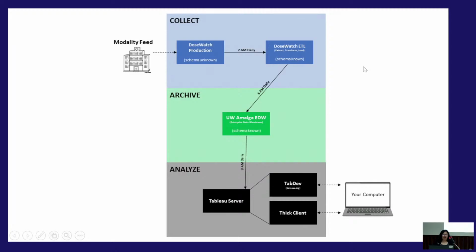So this is the way our setup is. From the modality, just like Sam mentioned, once an exam is completed from the scanner, the dose goes to PACS as well as to Dosewatch. And that's where it's collected. Then we have an archive server, or what they call an enterprise data warehouse. And then we said, you know what, Dosewatch does not give us a playground where you can just play with the data.